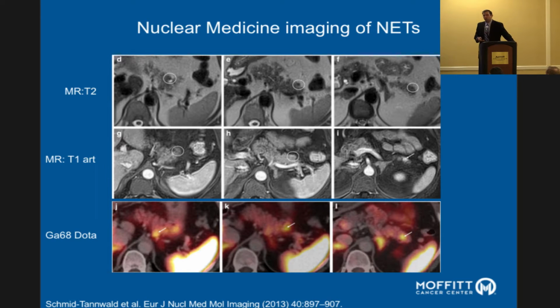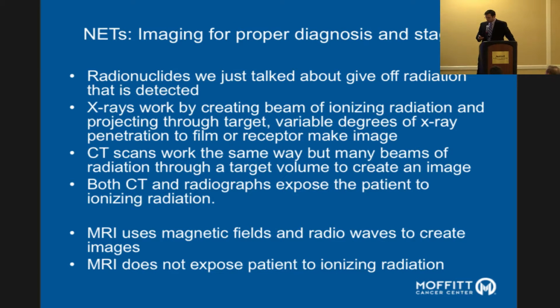That's why this can change management, because if you want to resect these pancreatic tumors, you want to know if there's more than one, because that's totally going to change your surgery. And pancreatic surgery, regardless of who's doing it, no matter how skilled they are, is a big deal. So these are revolutionary. Revolutionary might be too strong, but PRRT and gallium-68 are going to result in much better staging of patients with the gallium-68 PET CT, and another exciting avenue of therapy with PRRT.